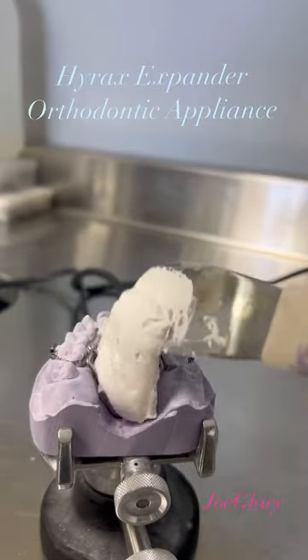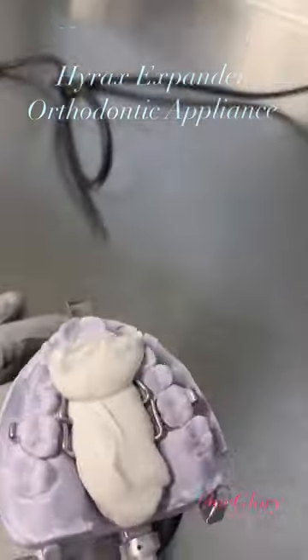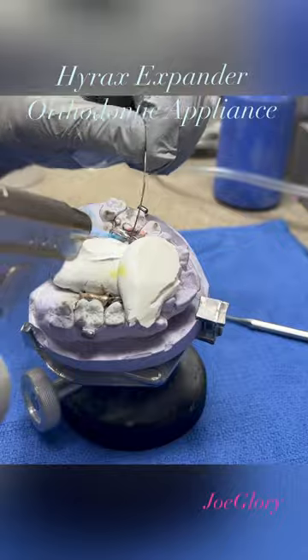I'm using this blaster just to cover up the metal — I don't want to overburn the metal. Now I'm ready for soldering, and I love soldering.